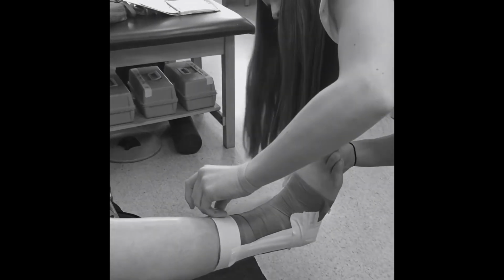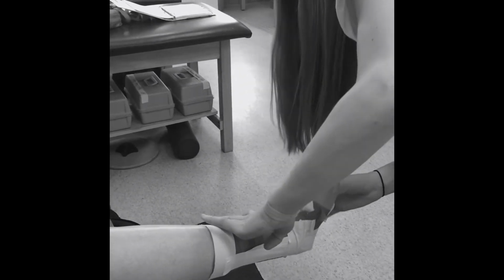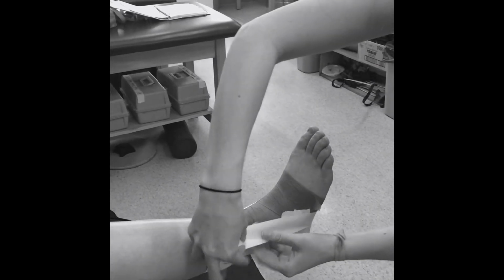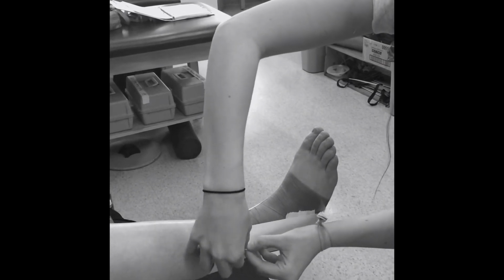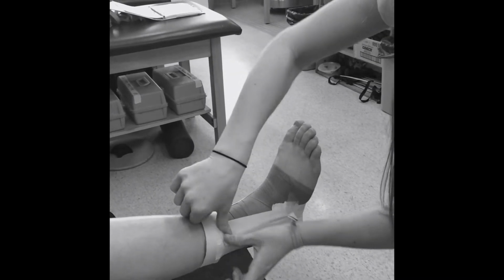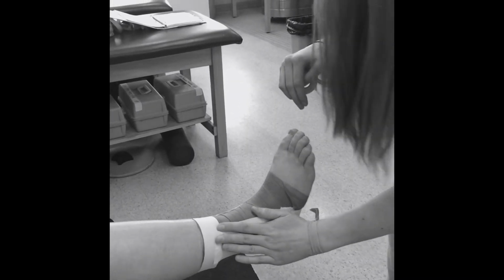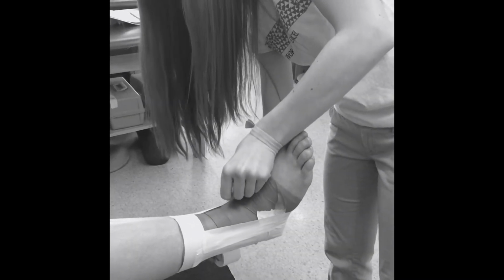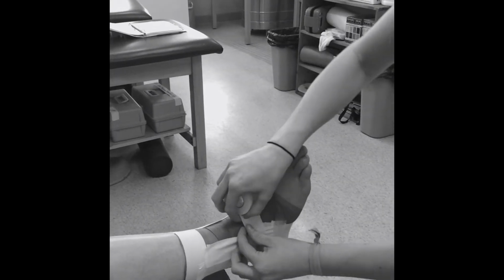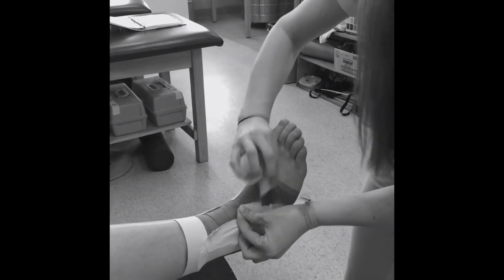You are now going to begin your third stirrup, remembering again to pull from the medial side of the ankle to the lateral side of the ankle. You're going to place this stirrup in front of your first stirrup. Complete your third horseshoe by covering 50% of your second horseshoe and locking in all 3 stirrups.